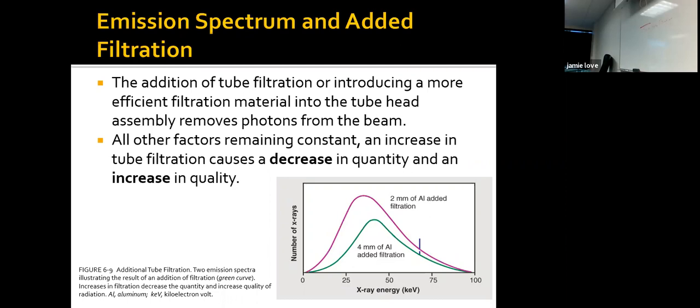Because we have to use so much kVp to get through the shoulder joint to see in here, we can't really see the bone here. So a boomerang filter, you put it under the patient's shoulder, it absorbs some of those high energy photons from here, so we don't have the burnout of the greater tubercle. Supposedly, like I said, I've never used it. Yeah, it would be nice. So generally speaking, we adjust things on the control panel with the computer now, or we just have a really light shoulder joint if we need to see over here, if this is the area that's hurt. We don't use a high penetrating beam, so we can see that area.